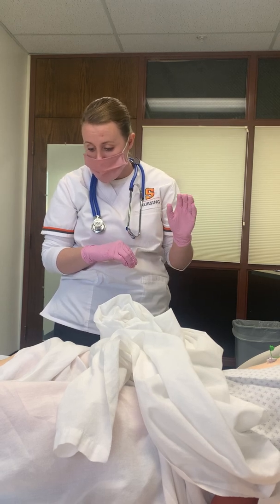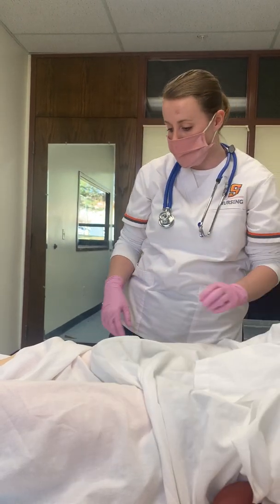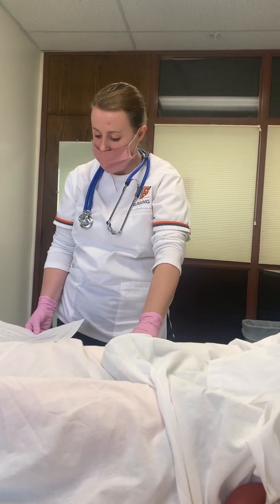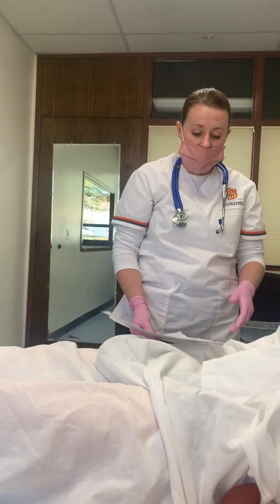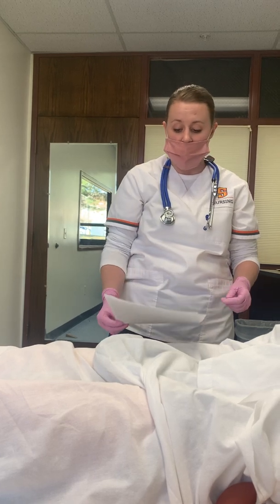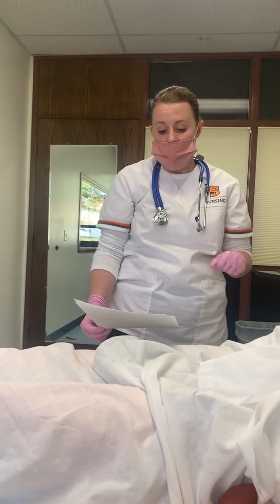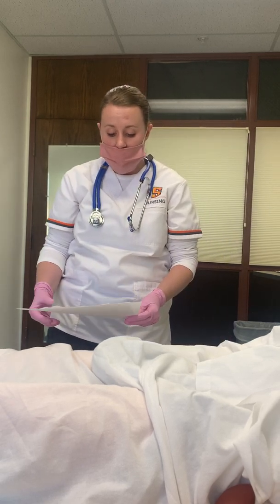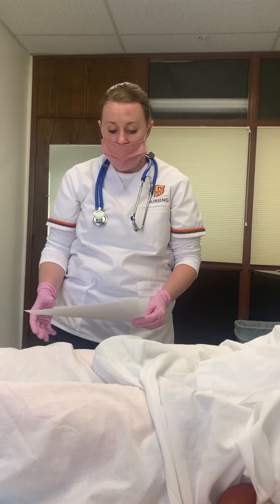Okay, so Addie's going to get a Toradol shot. It is going to be an IM injection with a 1-inch needle. It's going to go right here in her vastus lateralis. Side effects that you need to know about are indigestion, diarrhea, drowsiness, headache, and reaction at the site of injection. She's going to get 1.9 milliliters, and it can be in 1 shot.